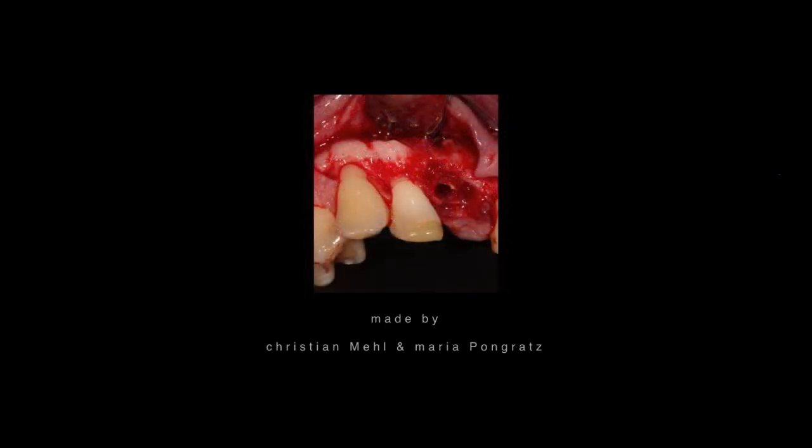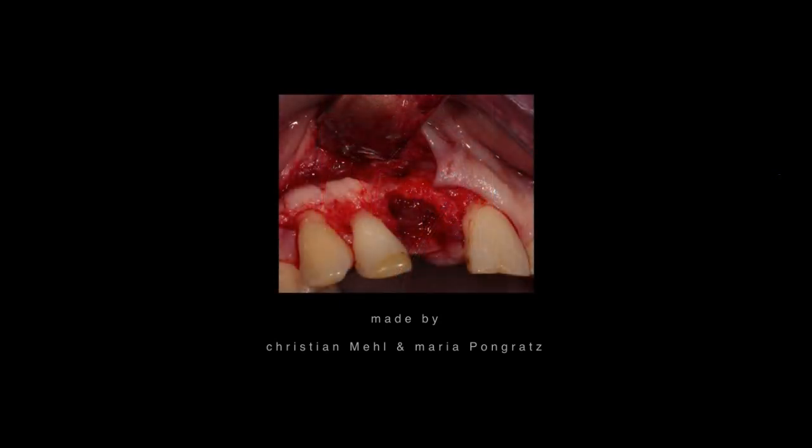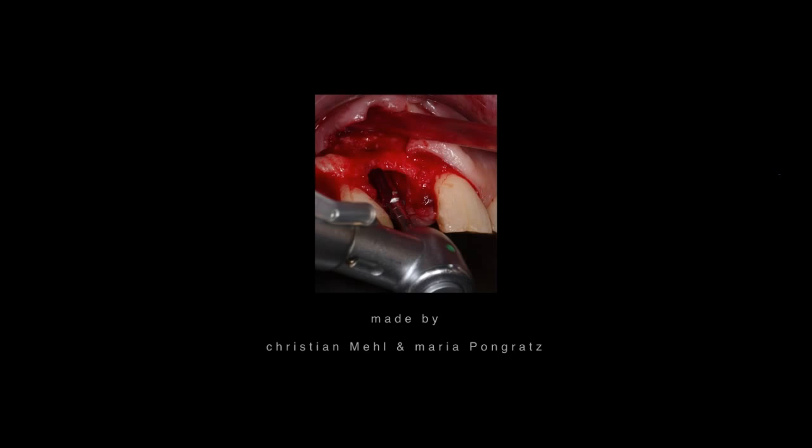Then we always split the tooth in half in mesiodistal direction. Remove the tooth very carefully, not to destroy any of the buccal or surrounding bone. Here we can see the extent of the inflammation with the buccal fenestration, and of course then we have to really properly clean it. And here the situation is clean, so that we can prepare for the implant. This is a tooth, insufficient crown, vertically fractured tooth, metal post exposed to the bone. And of course that results in inflammation.